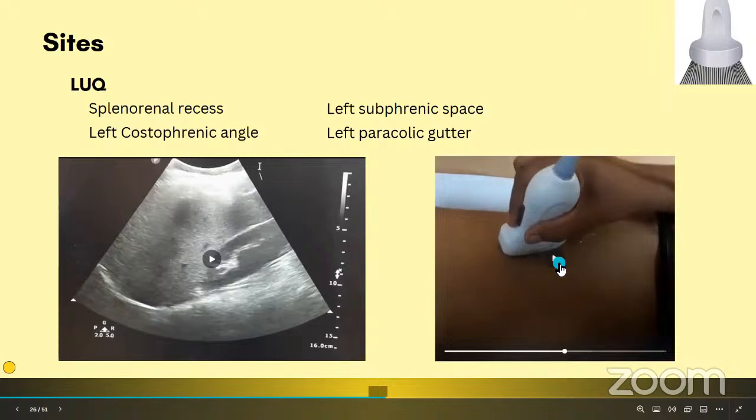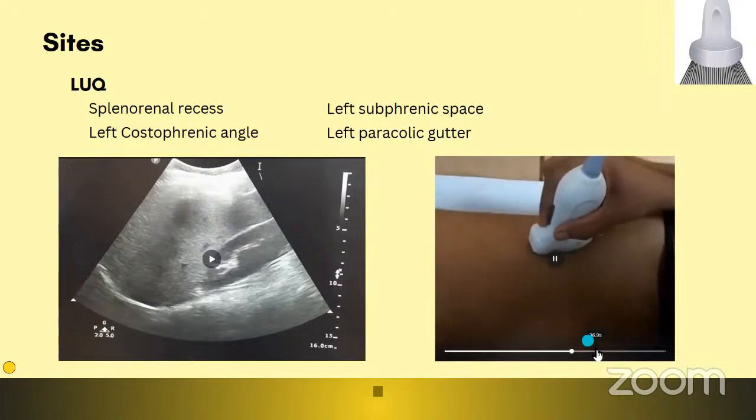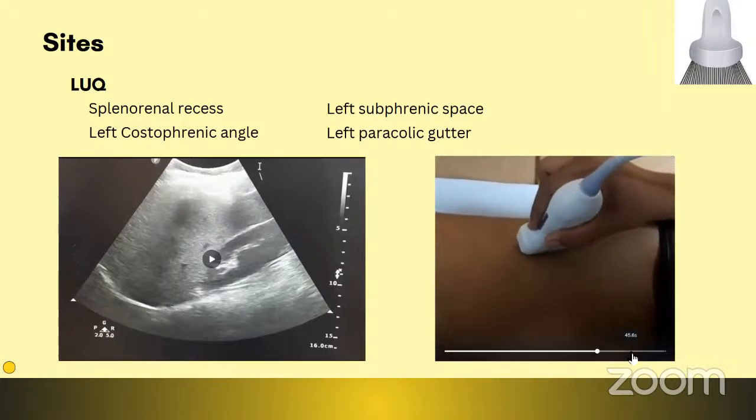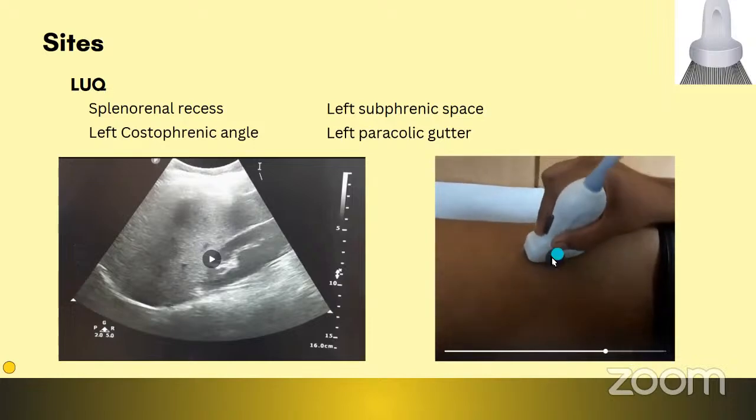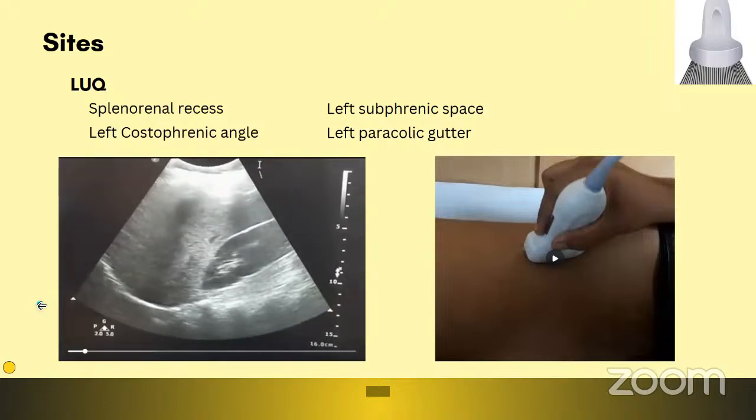And just another small piece of information, you can see gel here. The suggestion is to use an ample amount of jelly so as to reduce the air interface between the probe as well as the skin. Good. So let me show you the ultrasound image which I recorded.